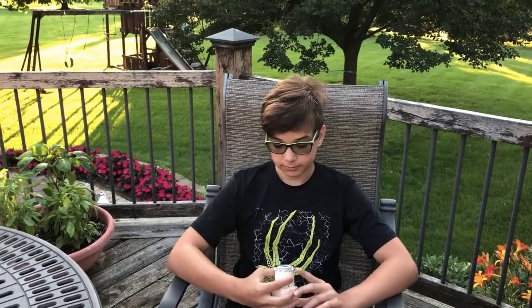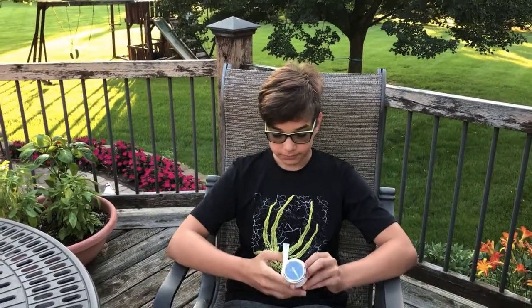Okay, so we are now done with our three trials of expiratory reserve volume, or ERV, and now we're going to be measuring our vital capacity. And remember, vital capacity is pretty much you take your entire inspiratory reserve volume, your tidal volume, and your expiratory reserve volume. So it's really the whole thing. It's almost your total lung capacity, except we really can't get rid of that residual volume. So it's everything but the residual volume.